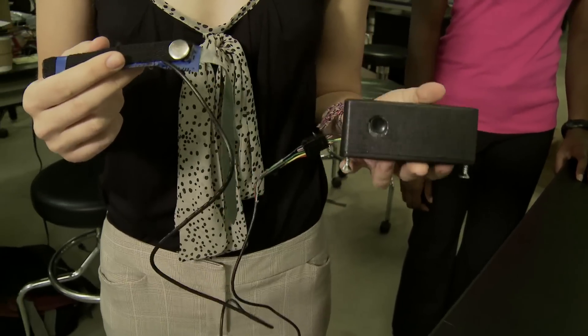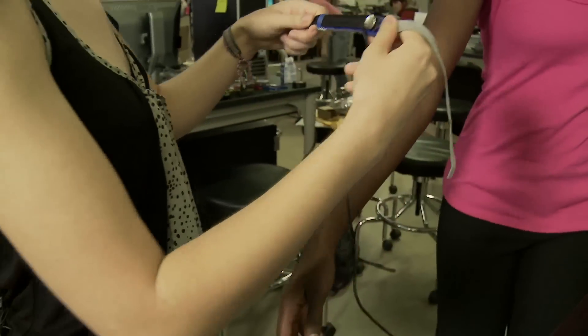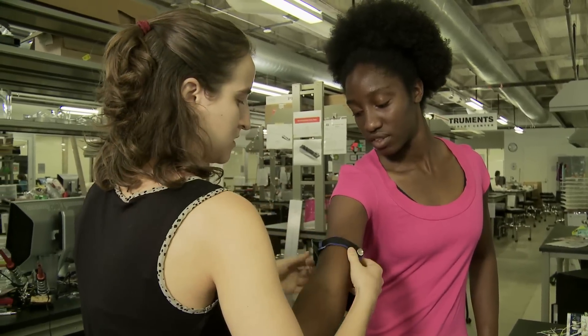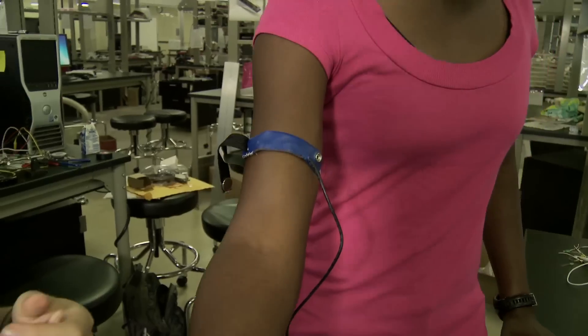This is our Babalong apnea monitor. Here is the little black box that stays next to the baby, and here's the strap. I'll demonstrate it on Bridgette — her arm is about the size of a premature infant. We strap it on, undo the clip, and turn it on.